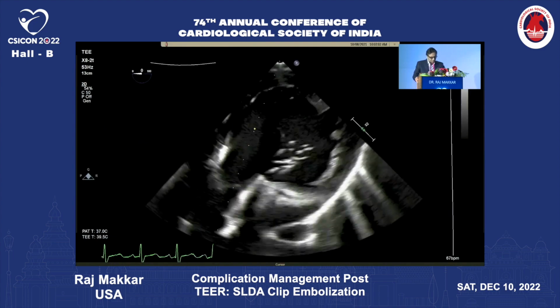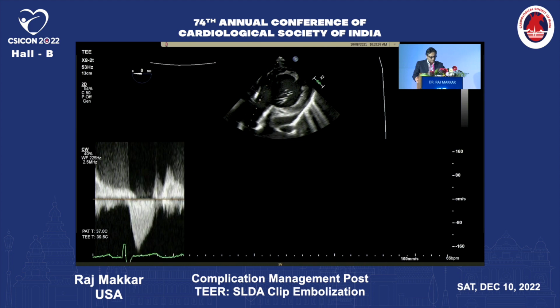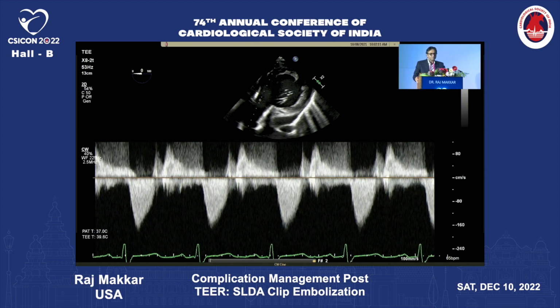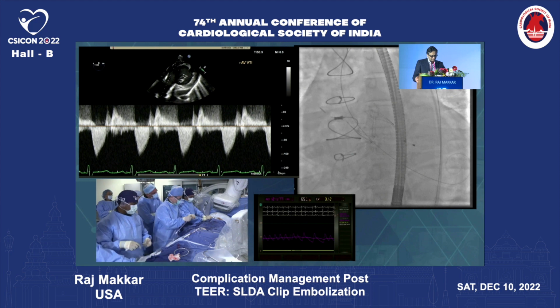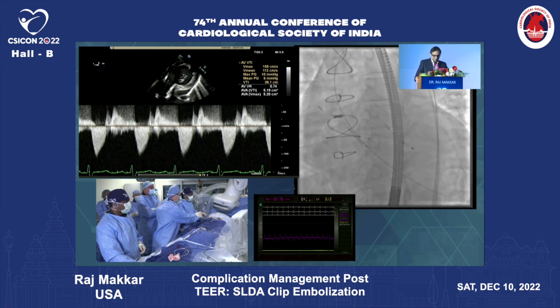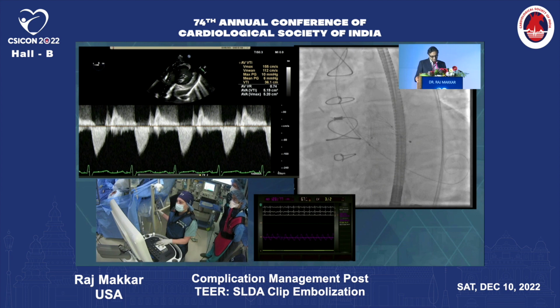So we'll take the time to kind of look at the gradient of the valve. And with that, hopefully we'll be able to measure an aortic valve area, since we already plugged it in. What I can tell you is I'm not feeling the pistol shot femorals anymore as I'm pressing on these. So based on what I'm seeing now, the mean gradient is 6, and the valve area by continuity is 5.2.